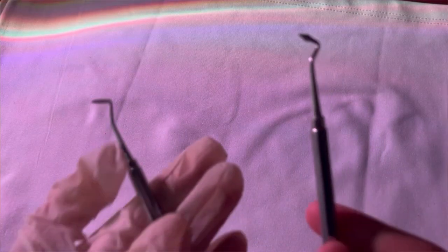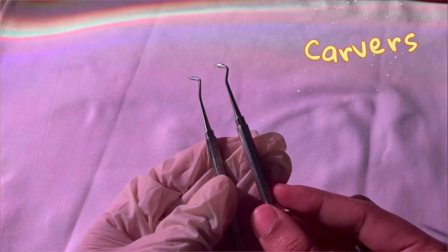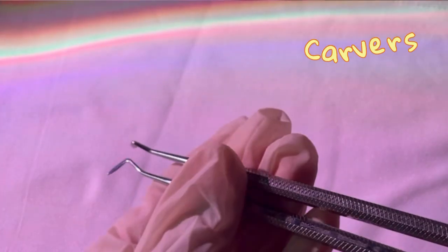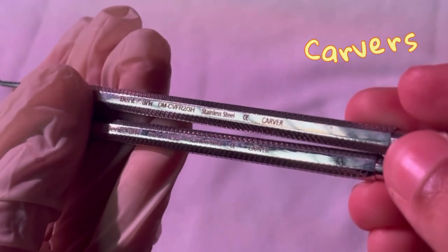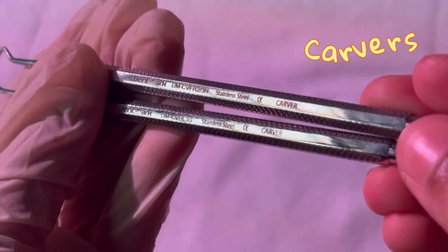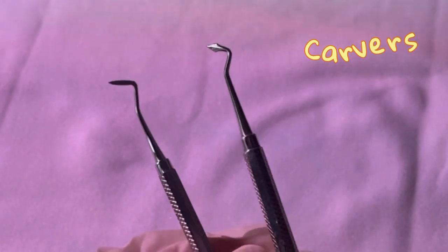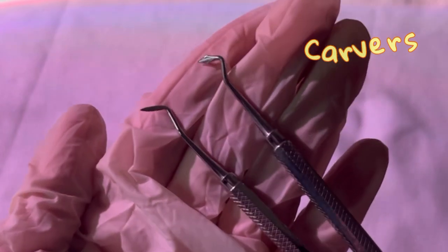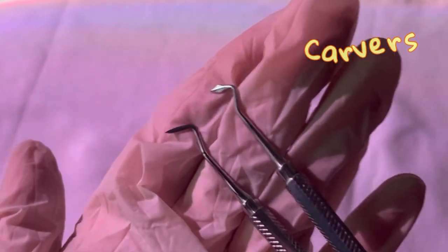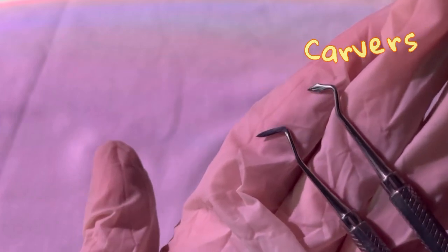Then you will have two carvers — two different types of carvers. These carvers are usually used to shape and carve wax patterns or dental amalgams during restorations.